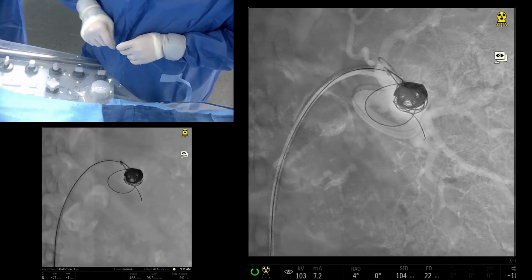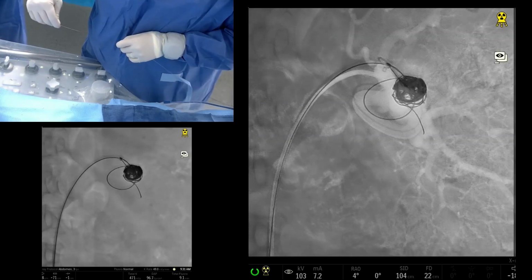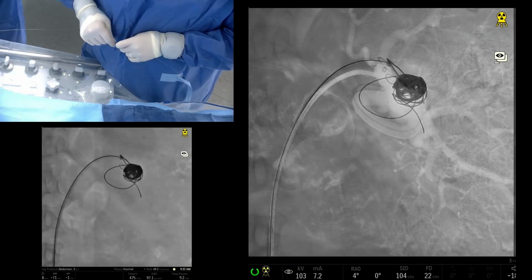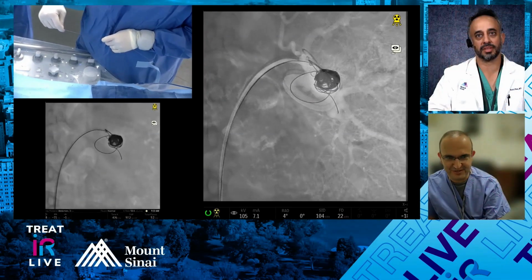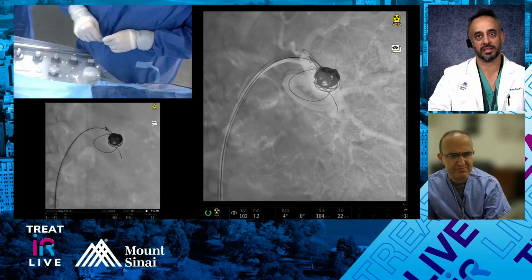You think it's a big deal that it's flipping in here? I think it's worth it. You've been doing this just like that. Yeah, perfect.